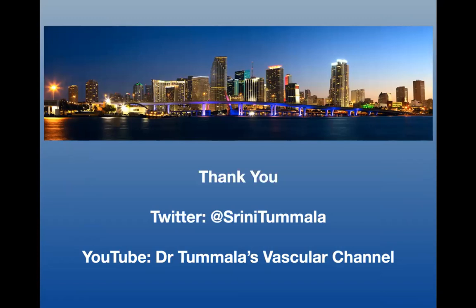Do you ever use a recanalization device like the Bard crosser to try and stay true lumen, intraluminal, in cases like this? Yeah, so you can use crossing devices, but remember, even the Bard crosser doesn't keep you intraluminal. It basically goes whatever direction you're pushing it. So any of these crossing devices will not keep you intraluminal, but you can use them as a recanalization device.